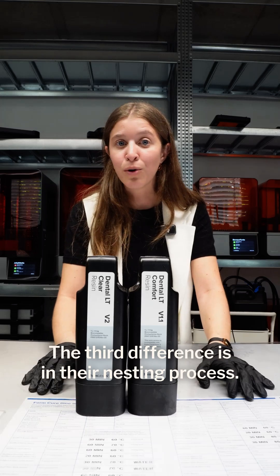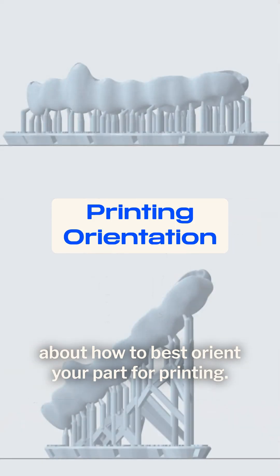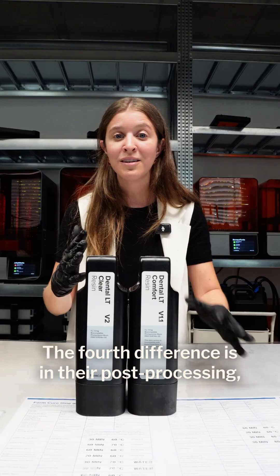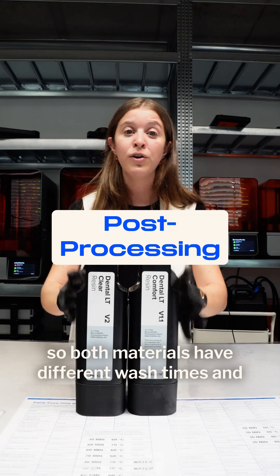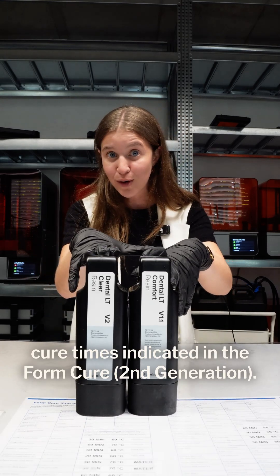The third difference is in their nesting process. Both materials have different indications about how to best orient your part. The fourth difference is in their post-processing — both materials have different wash times and cure times indicated in the documentation for your printer.